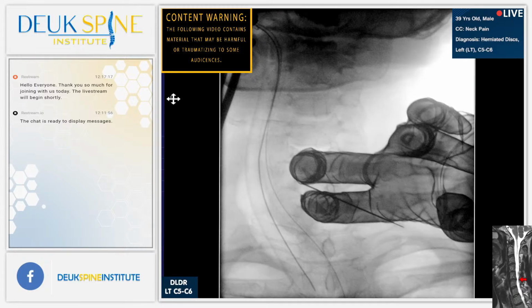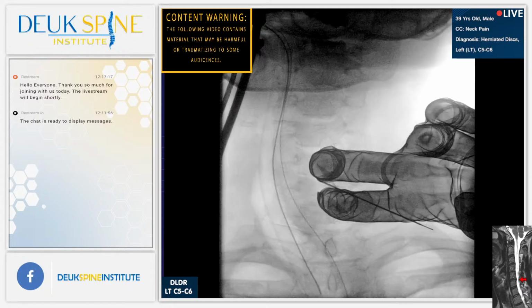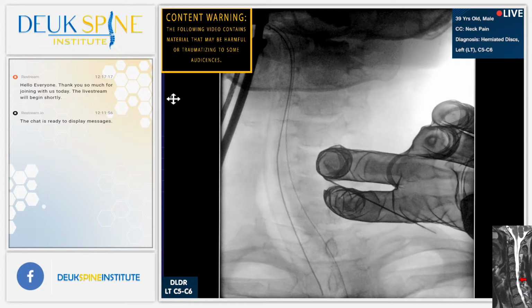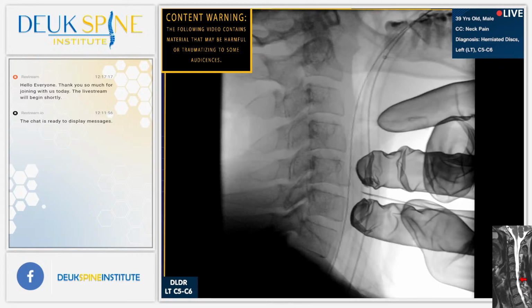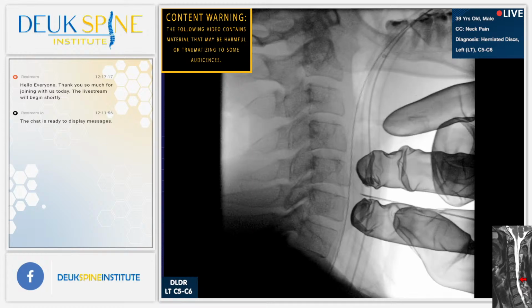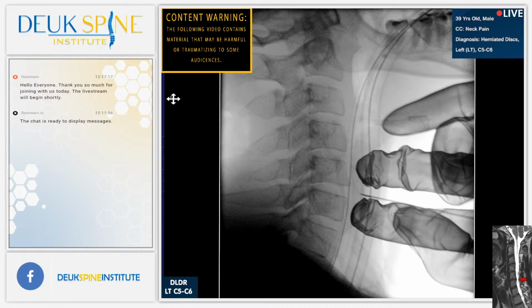All right, I'm way off to the other side, so he's doing awesome. Shot. We're back to the center. Perfect. And again, shot. All right, that's the middle of the spine. Lateral view. Shot. Wonderful. 2, 3, 4, 5, 6. Luis, you agree we're at 5-6? Here we go. Shot. Wow. That went in nice and easy. Give me an AP real quick.